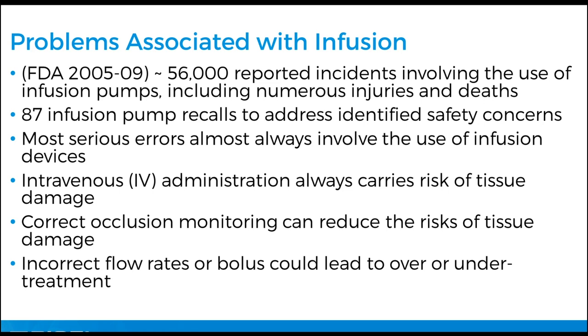So the FDA, in a similar time period, approximately 56,000 reported incidents involved the use of infusion pumps, including numerous injuries and deaths, which is, you know, unfortunate. Effectively, when I do these type of talks, not so much infusion, but everything that we manufacture is pretty much based on patient safety. And when I put these things together, it really saddens us, I must admit. 87 infusion pump recalls were identified with safety concerns.